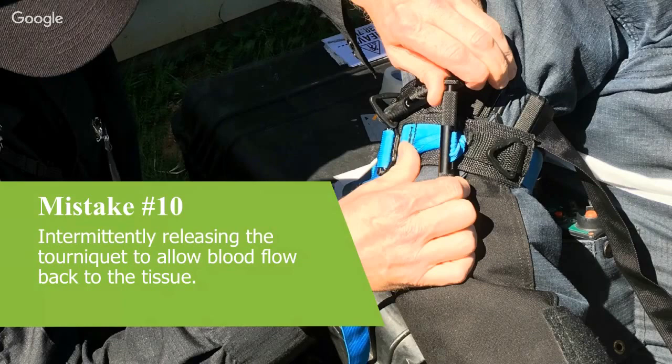Certainly, you don't want to leave it on long term. You want to get that thing off as soon as you can. Now, your options for getting it off are, if you put it on in the care under fire phase or a tactical type environment, then the first opportunity you get when it's safe to do so, you want to reassess it. So have a good look at the wound, cut the clothing off, work out if the wound is actually arterial or venous if you can, if you're appropriately trained to do so.